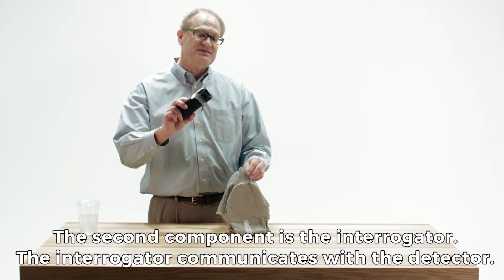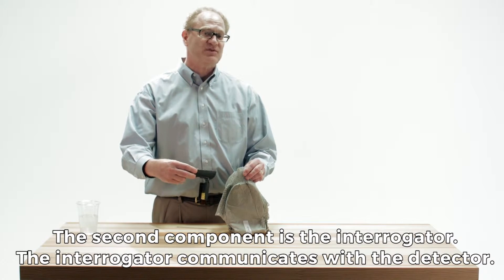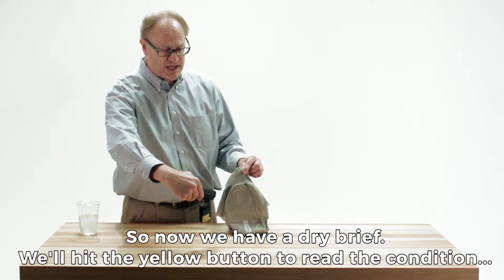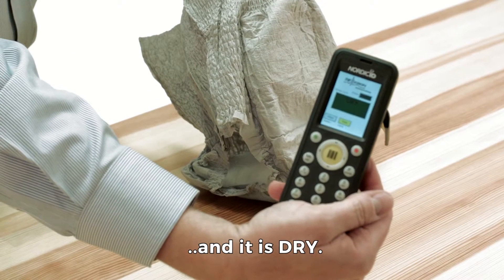The second component is the interrogator, which communicates with the detector. So now we have a dry brief — I will hit the single yellow button to read the condition, and it's dry.